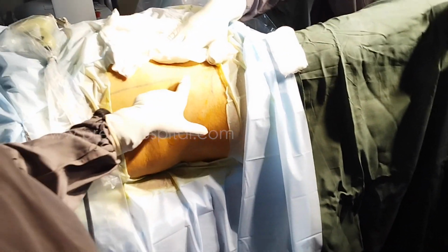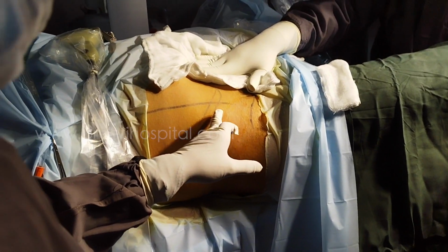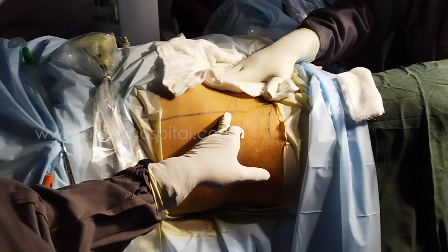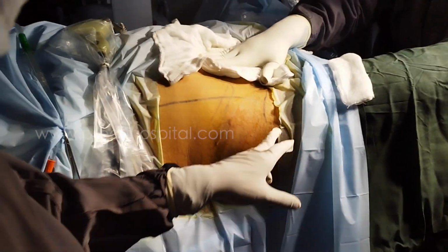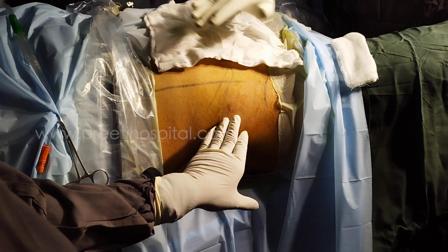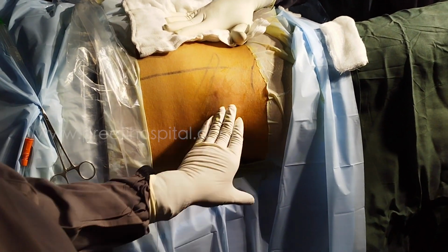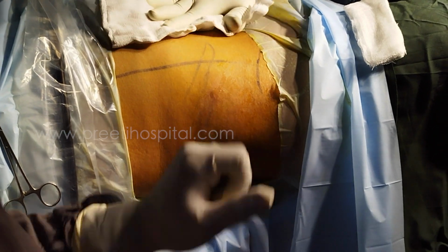Now, what is the most important landmark? You know how to draw the posterior axillary line. You know the 12th rib. The lower border is below the 12th rib. That means the lower pole will be here. Don't forget about ultrasound. This is the iliac crest. When you feel it, you feel the resistance type of wall. These types of walls do not offer resistance for puncture.